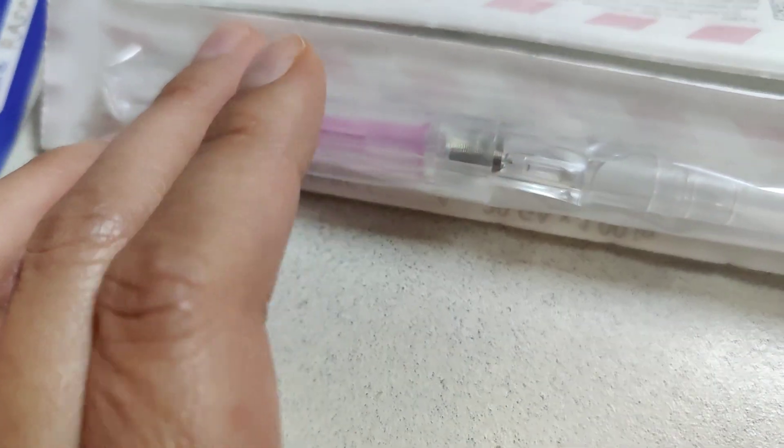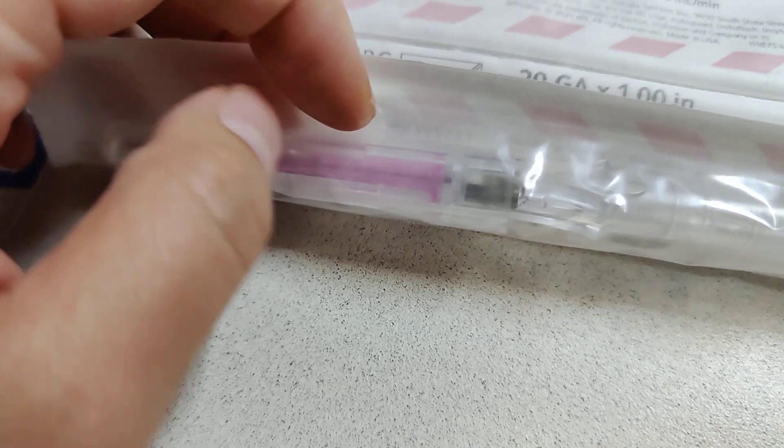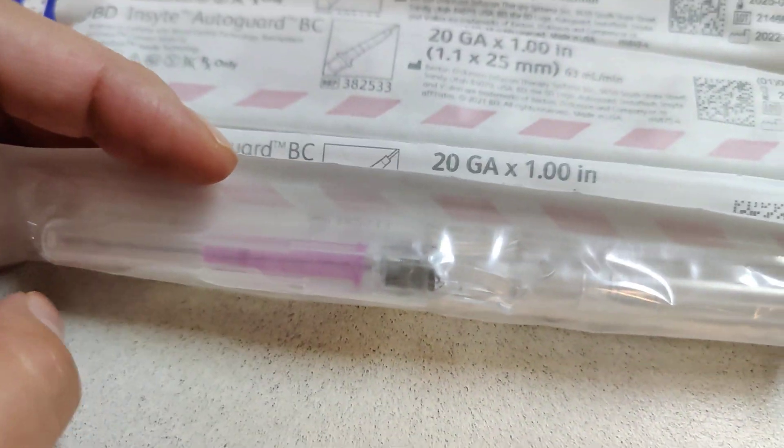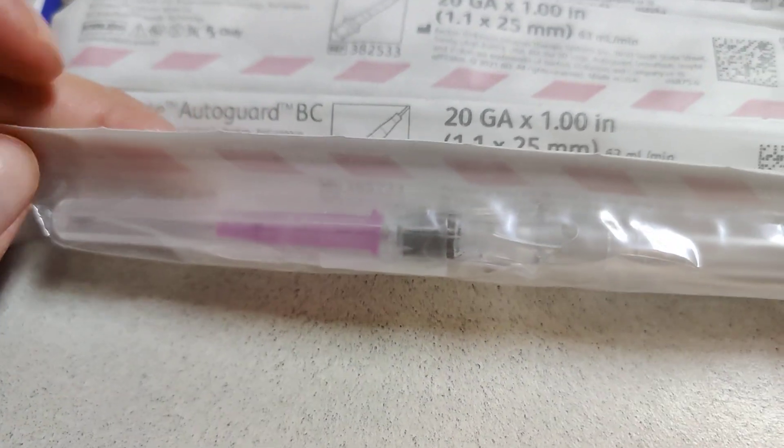You literally just take the needle out and the blood doesn't squirt out — it just holds there until you're ready to put the hub on. It's less messy and it gives you time to reach for things if you don't have them ready or whatever situation you're in.